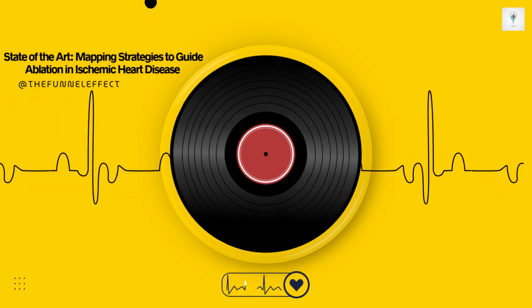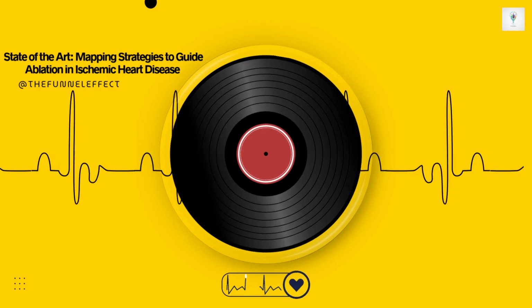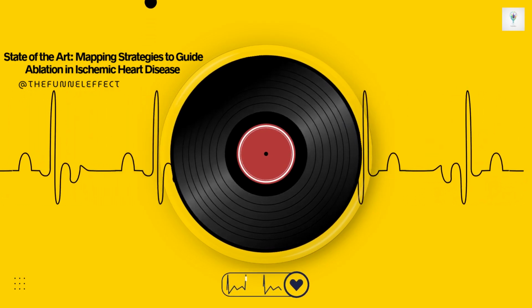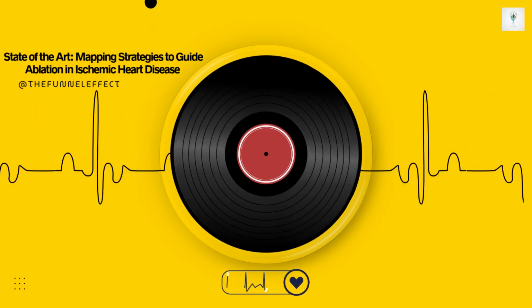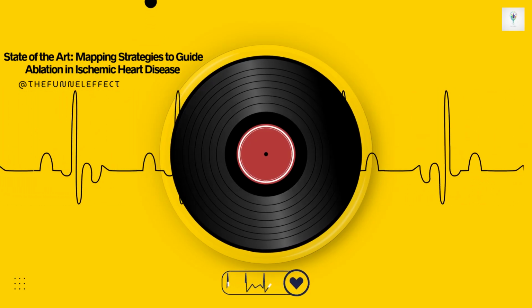Second, the timing has to be right. The interval from your pacing stimulus to the start of the QRS complex, SQRS, must be the same as the interval from the local electrogram at your site to the start of the QRS during the native VT. This confirms your pacing is activating the local tissue at precisely the right moment in the cycle.